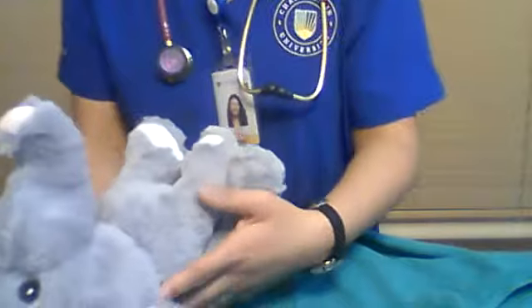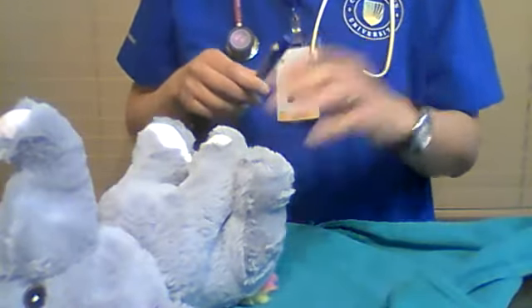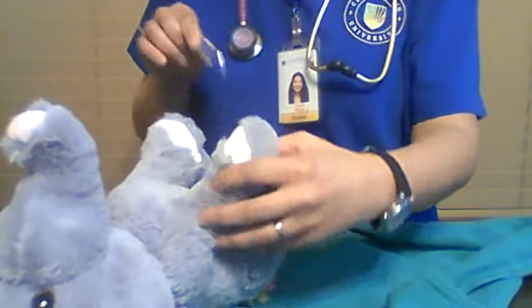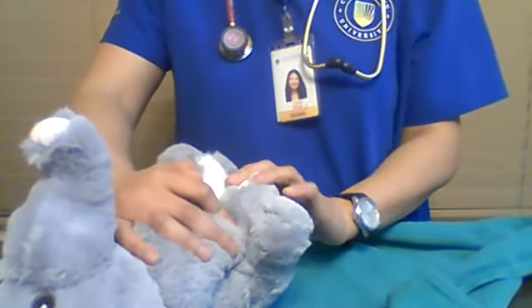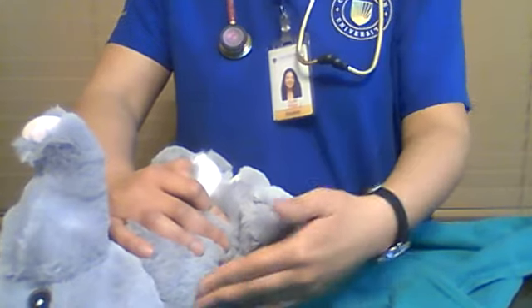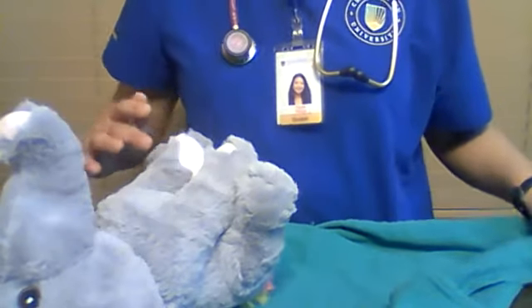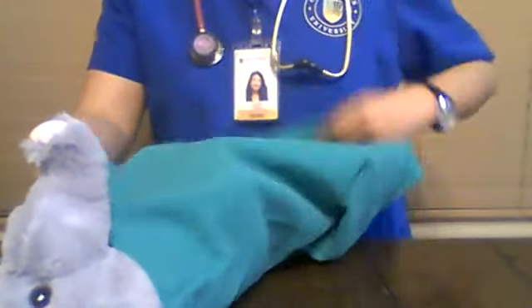Go ahead and put the baby back down. And last but not least, we'll take the baby's temperature, and this will be my thermometer. I'm going to put it inside the axilla, like so, and hold for the baby to take the temperature. That way I know that the thermometer probe is inside the axilla and won't be sticking out or anything like that. And then I'll get the temperature. We are at 98, which is in range. We should expect anywhere from 97.7 to 98.9.